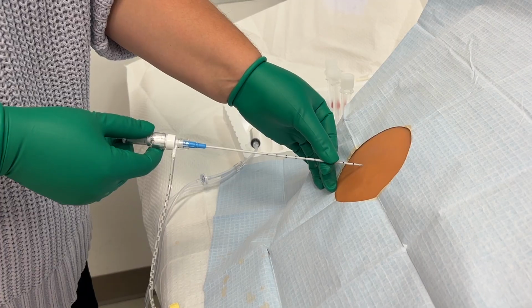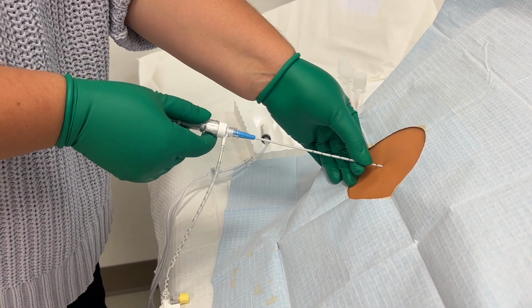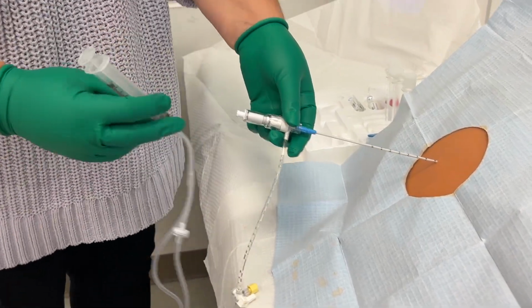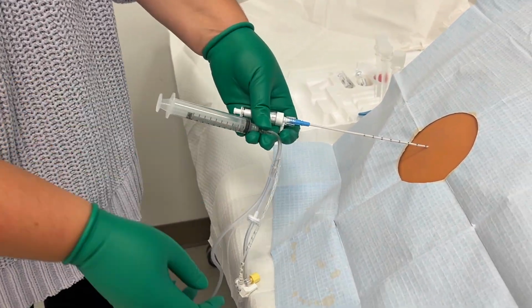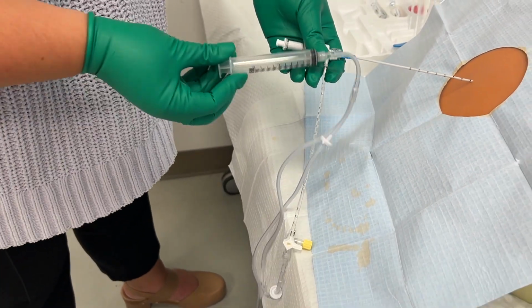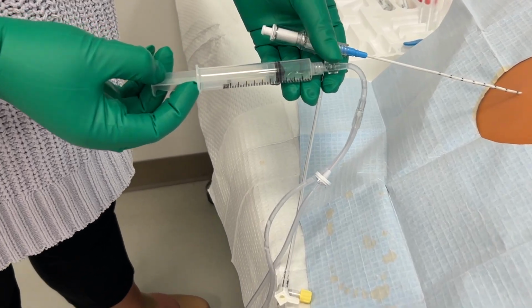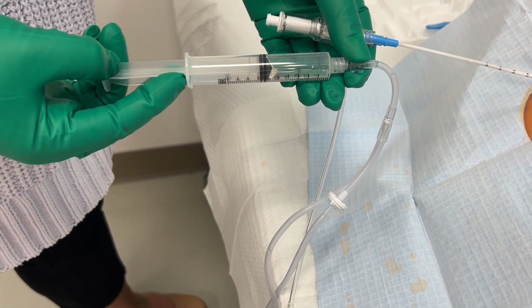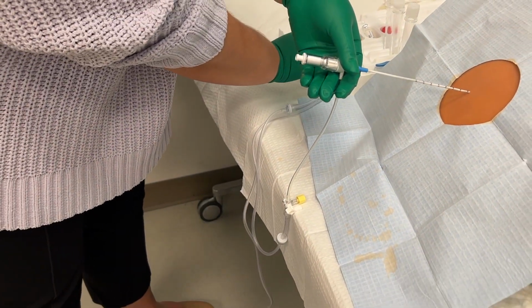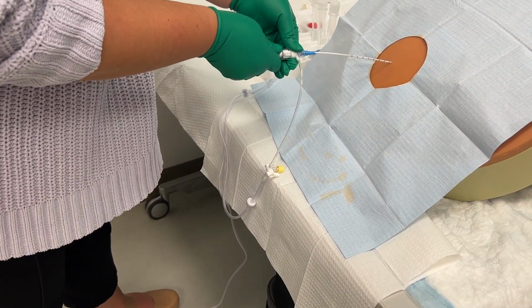The insertion of the catheter is the same process for both the diagnostic and therapeutic paracentesis, using the pistol grip. Once you've lost resistance and believe you are in the pocket of fluid, make sure the stopcock is turned away from the tubing so that the fluid can flow, and aspirate using the syringe to confirm that you are in the correct pocket. Once you have confirmed your location by aspiration, you can remove the needle from the catheter.